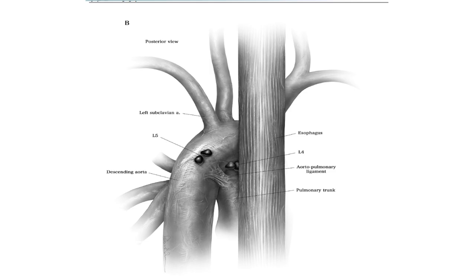Station 4L and 5. What divides station 4L and 5 is the aortopulmonary ligament. 5 is an AP window node. In most cases, we can access this via the esophagus without traversing the aorta. But sometimes, we also do transaortic biopsy of these lymph nodes. We have a paper from many years ago in JTCVS where we published a case series of 36 patients with transaortic biopsy with no complications and about a 73% yield in that study.